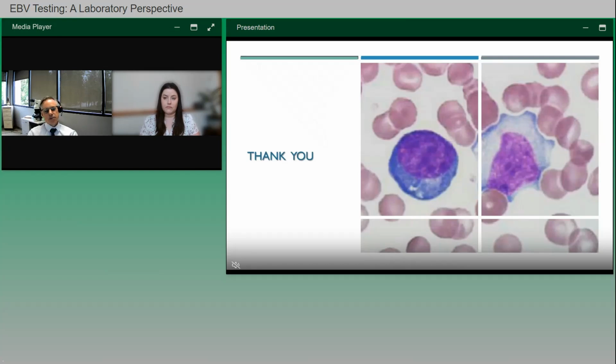And so there are some labs that offer assays where they actually do fractionated WBC counts, and then with immunobead harvesting, or I think there's even fluorescent labeled flow cytometry, which is like flow FISH methods, to actually find the EBV in those specific T cells. So they want both those things, a high PCR as well as finding that in cells themselves. And those are kind of diagnostic criteria for chronic active EBV.